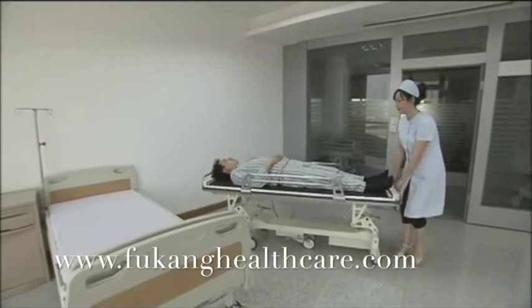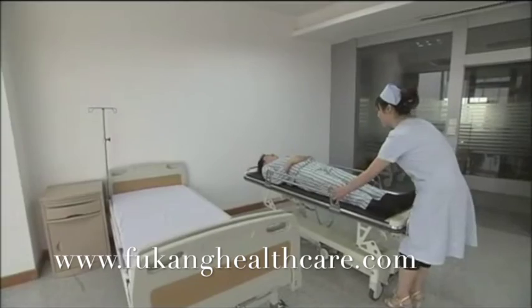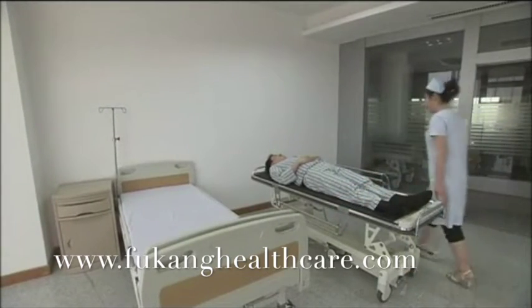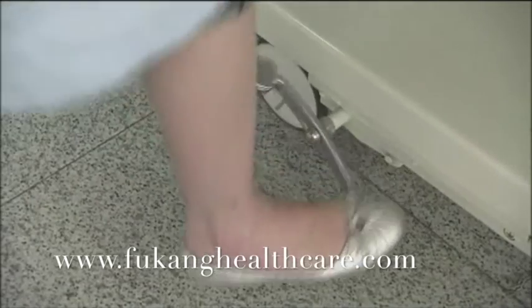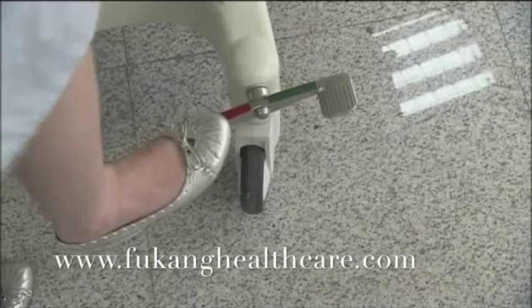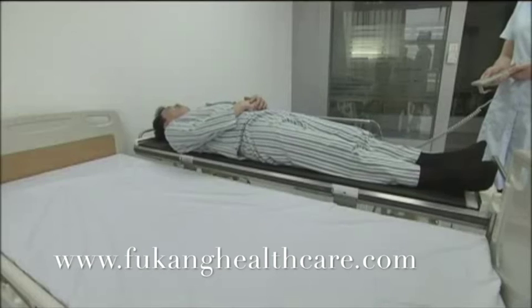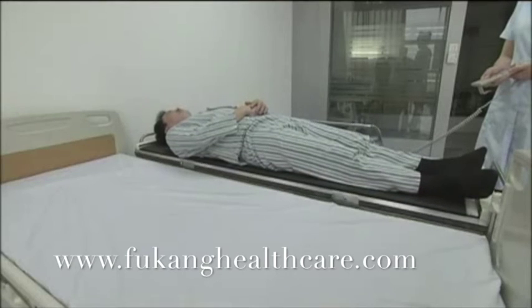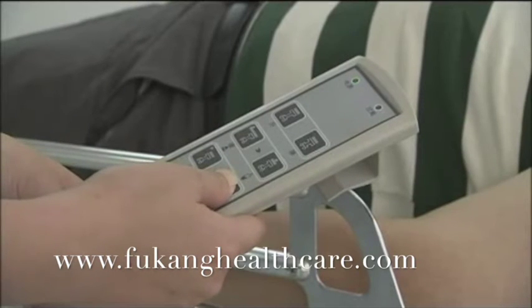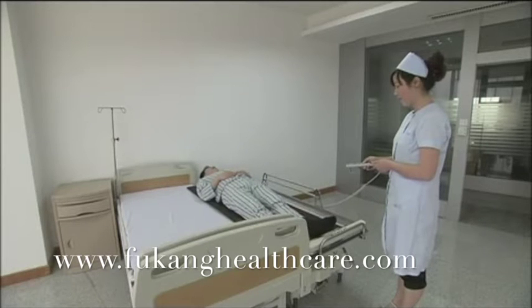When arrival, push down the side barrier and release the oriented wheels. Then close the medical bed and press the brake. Adjust the height, press carry, and transfer the patient to the medical bed.